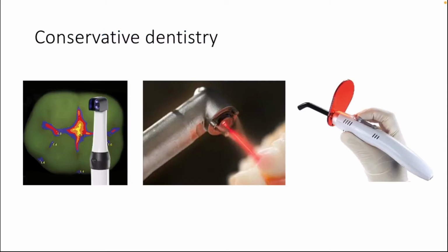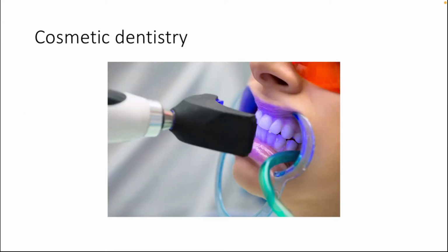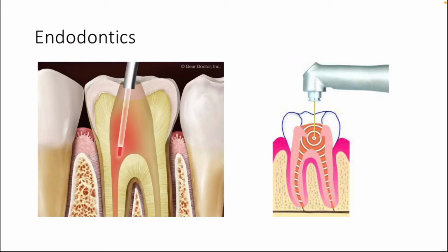First, conservative dentistry. Lasers have been used in conservative dentistry for detection and removal of caries, as well as photopolymerization. In cosmetic dentistry, lasers have been used for teeth whitening. In endodontics, lasers have been used for sterilization and preparation of the canals of the teeth to receive the filling.